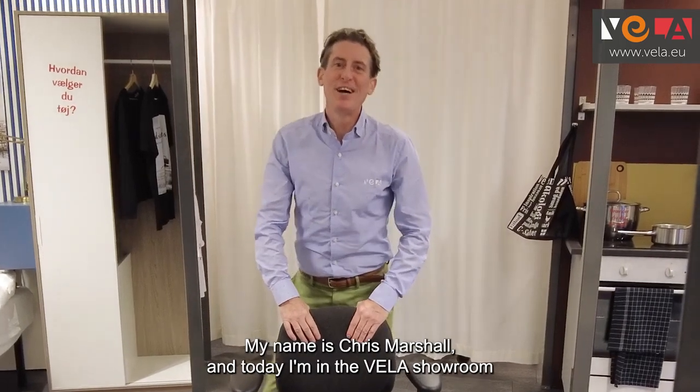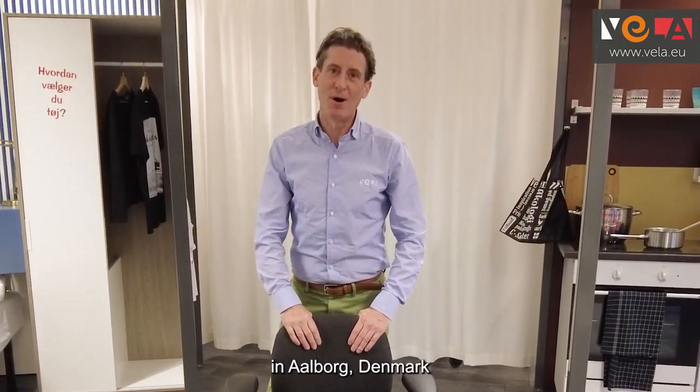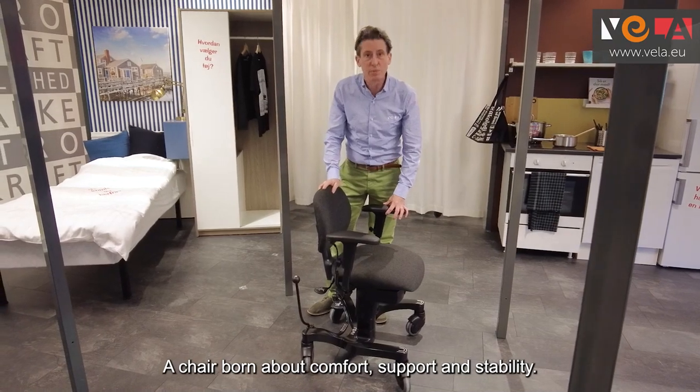Hi there, my name is Chris Marshall and I'm today over in the Vela showroom in Aalborg, Denmark to show you the Vela chair — a chair born about comfort, support and stability.